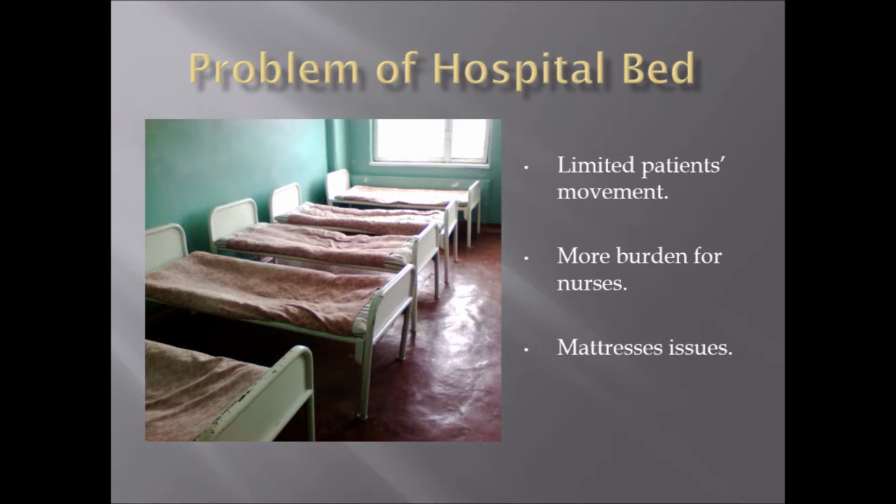It also increased the burden for nurses when the patient needs help to move their body into a sitting position, when their own movement eventually causes some trouble. For example, falling off or causing blockage to the sodium solution dripping. Some patients try to be independent as they don't want to trouble nurses with simple tasks, for example, adjusting their posture to their desired position, but end up causing trouble. The patient tends to slip downwards when sitting, which often requires nurses' attention.